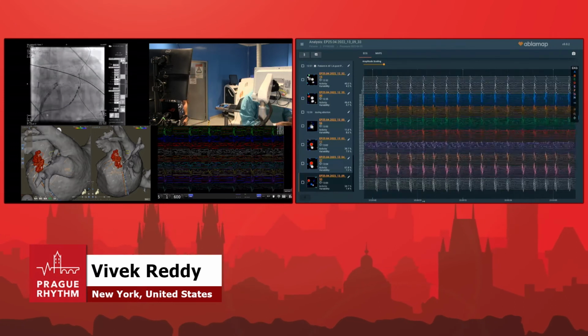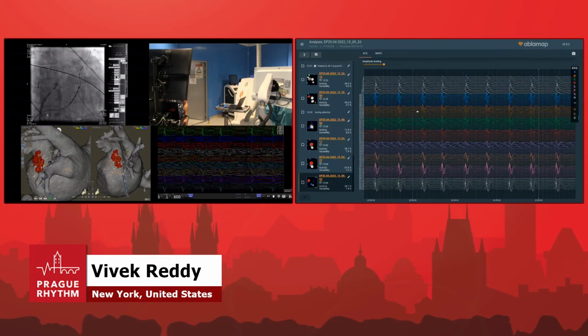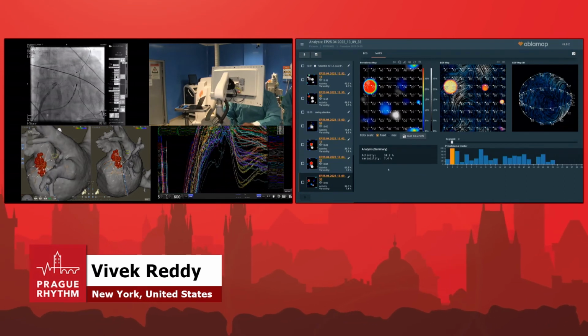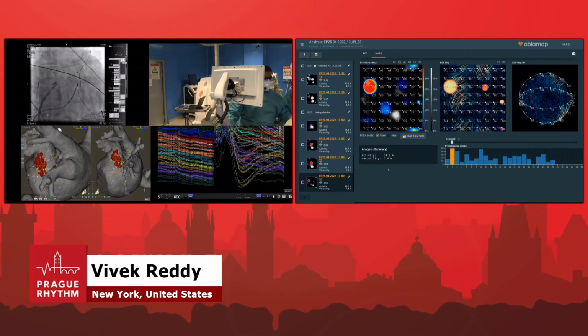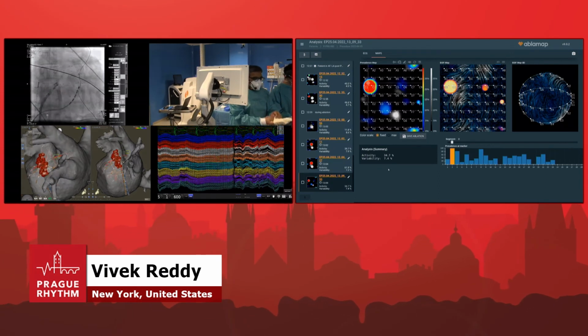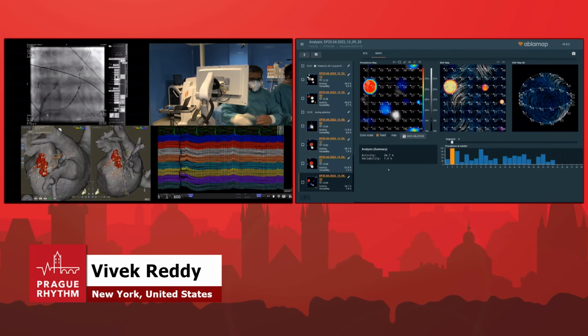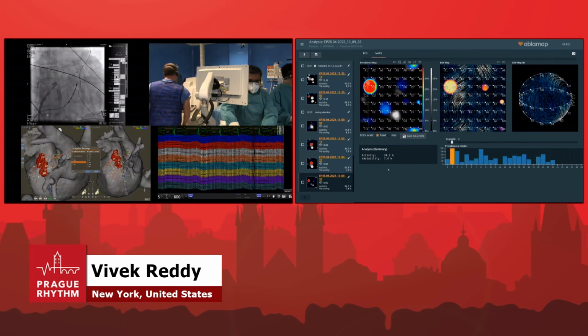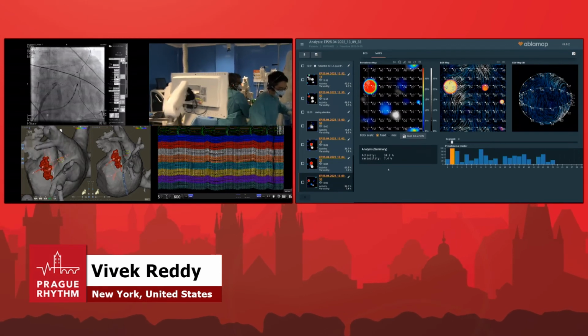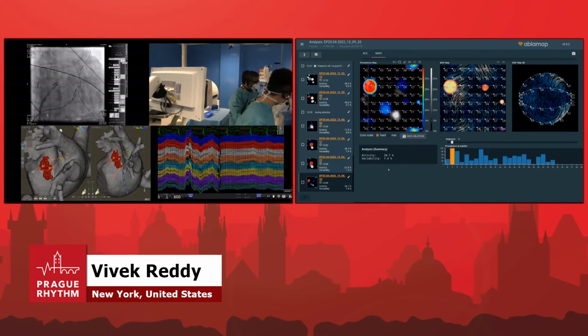The problem is that we don't know exactly where the Farapulse catheter was, right? The PFA catheter is not linked to the system. I mean, the real problem we're dealing with is we're constantly going between systems. And it's just not a seamless situation. And this is what we have to deal with until we get their final system that we can play with. But right now, it's a bit kludgy, let's say.